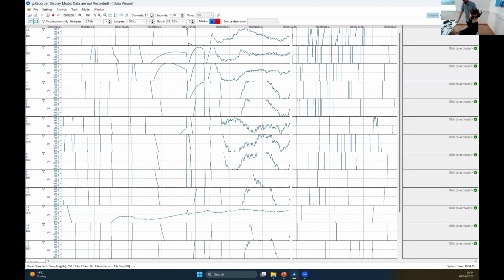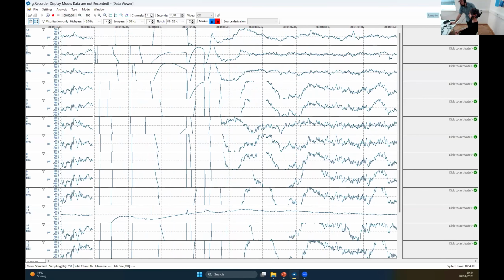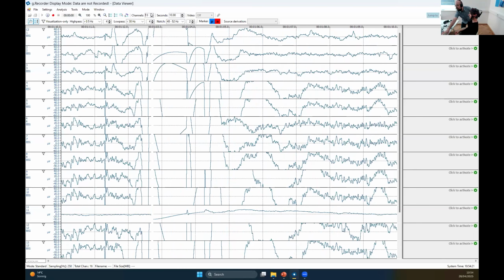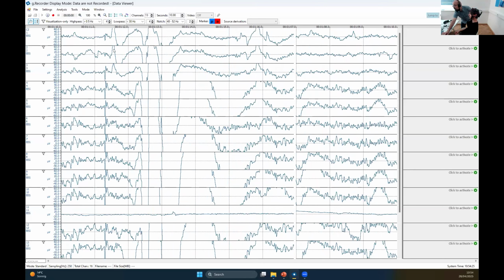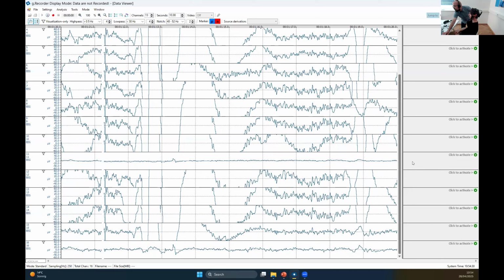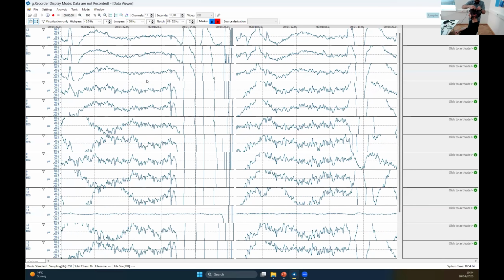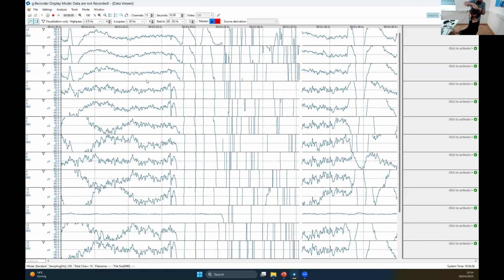So it's a bit better now. Just this channel here. And let's see if the letters on the back, they're also good. Just this 11, which probably is one of the connectors which you have to put better.